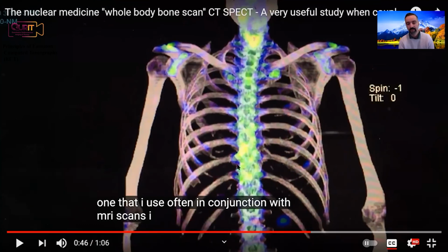Just to comment here, this is SPECT and CT. There's a lot of movement in combining SPECT with CT. And for example, we have now PET CT scanners, we have SPECT CT scanners. We're going to talk about multimodality also in the future. So the grayscale that you see, these are the CT images. And so often these are both in the same scanner. So it's a combined SPECT CT or combined PET CT scanner. So you're getting the CT for the anatomical imaging, and you're doing the SPECT or the PET for the functional images.